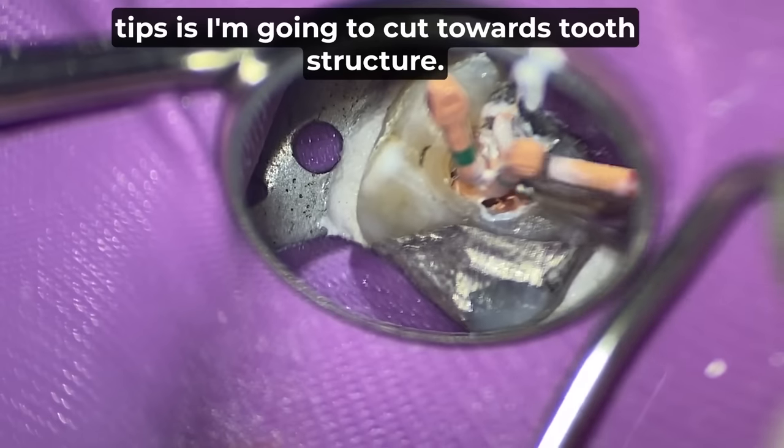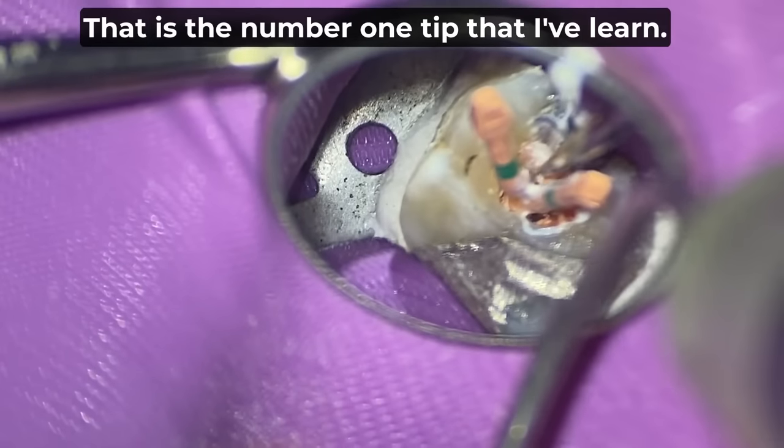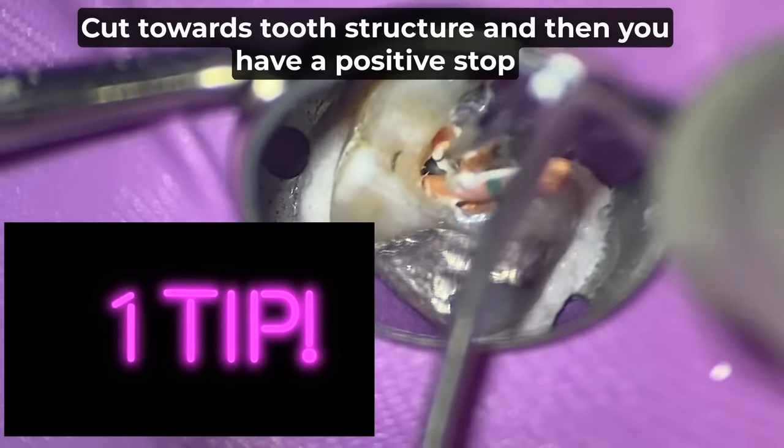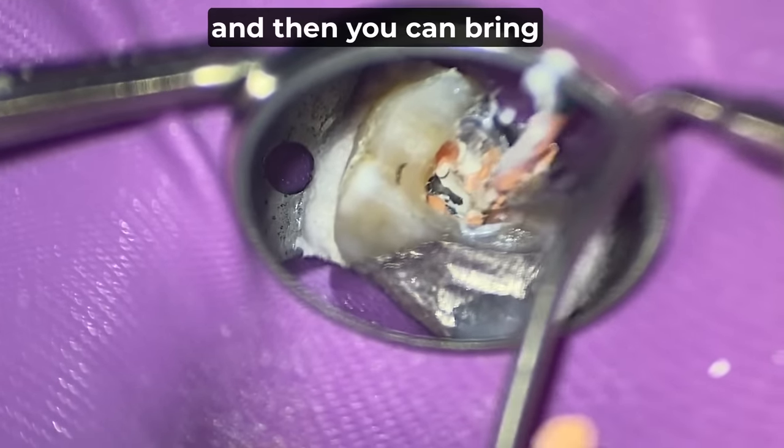One of the key tips is to cut towards tooth structure. That is the number one tip that I've learned. Cut towards tooth structure, and then you have a positive stop. Then you can bring that cone up.